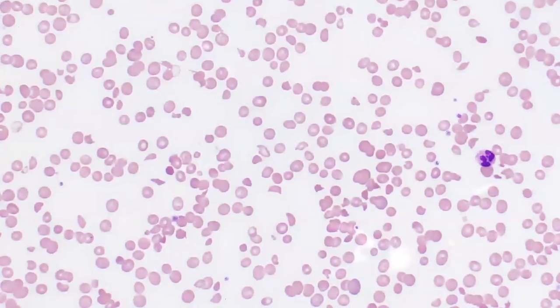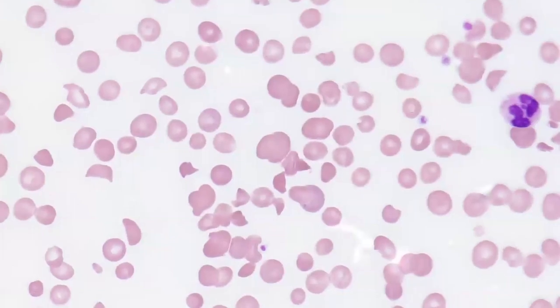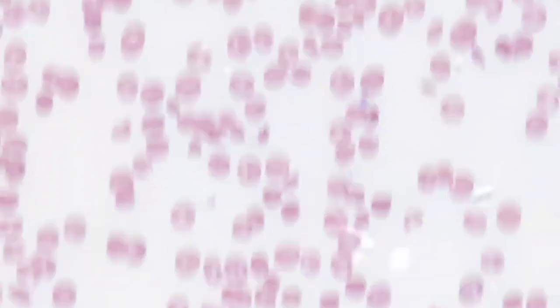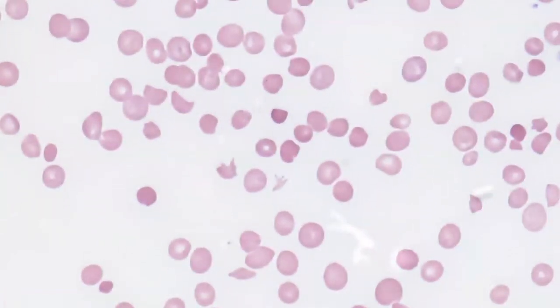So as we find our zone of morphology on this case of microangiopathic hemolytic anemia, we can see even at 50x that there are numerous red cell fragments. So let's take a closer look. So at 100x, we can see numerous cells that appear as though they were once red cells and now have been taken and sheared. Here's a very good example of a schistocyte in the center with a triangular morphology. When you see a red cell with 3 distinct points, that is a clear and distinct schistocyte.